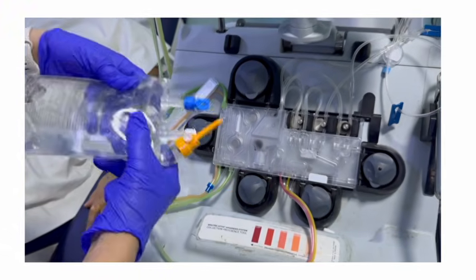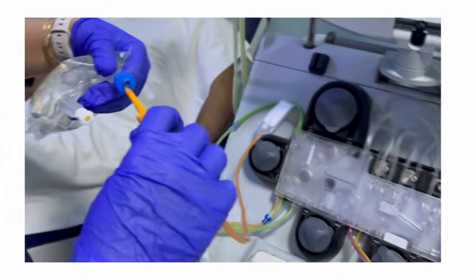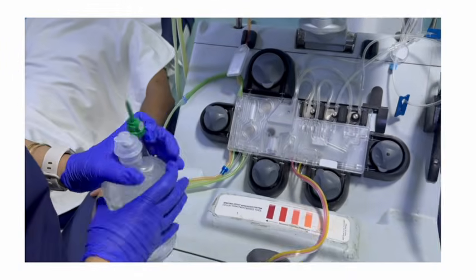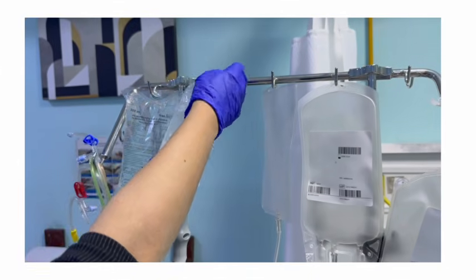Next, for priming the circuit, we have to initially spike the HES solution to which the trisodium citrate was added. Followed by this, we will have to spike 500 ml of normal saline also, which is used to prime the circuit of the tubing set.